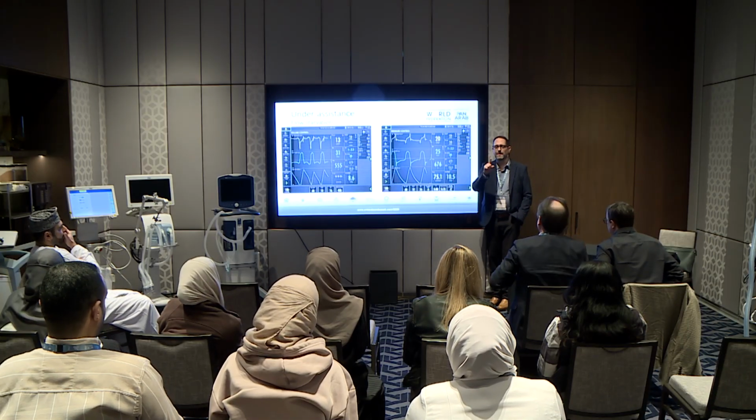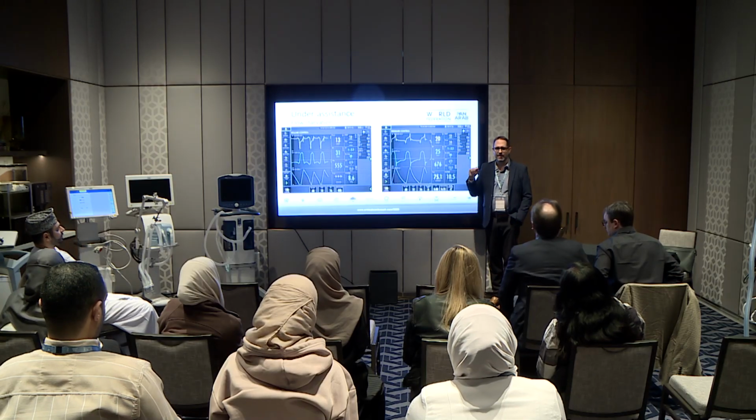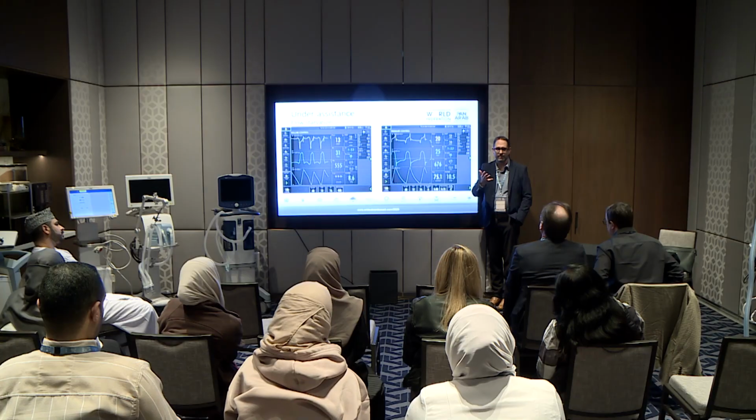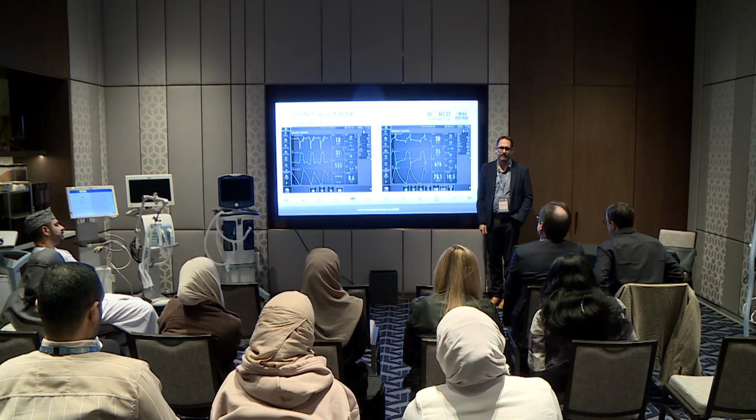This is the lady who was not the PEEP responder. Remember the EIT talk? We sedated, paralyzed her, we did EIT, non-responder, we proned her. So this same day, we proned her.